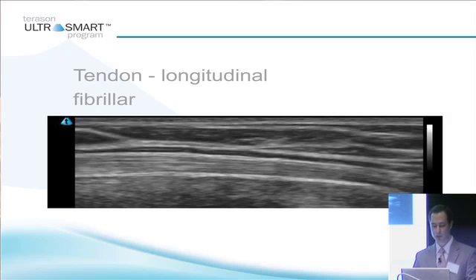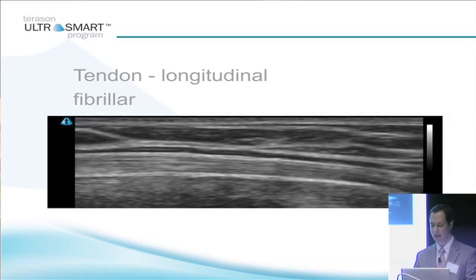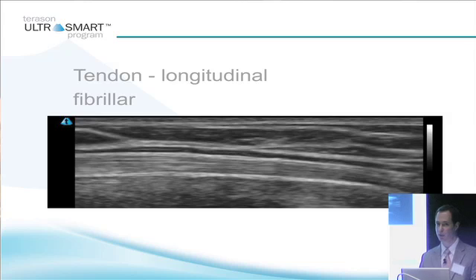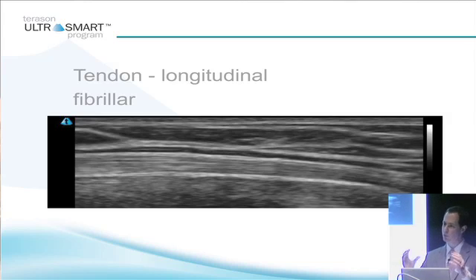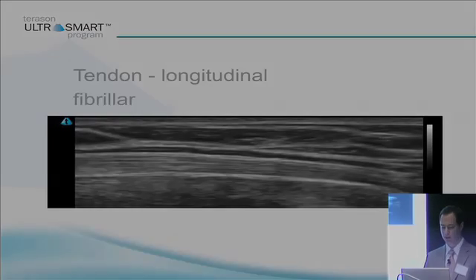A longitudinal view of the tendon will look fibrillar — it's got fibers going from one side of the screen to the other. Again, very much more dense. If you could see these bright lines, they look similar to the bright lines that were in the muscle, but much more compacted and much more dense than muscle.